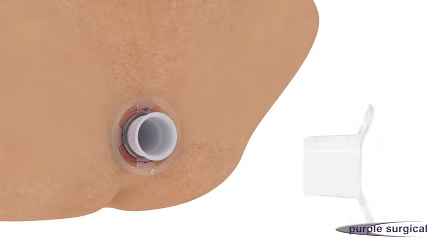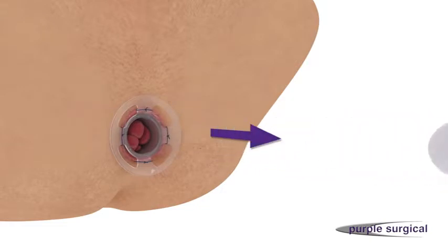Remove the anal dilator obturator to allow the prolapsed mucosa to fall into the lumen of the clear anal dilator and for direct visualization of the dentate line.